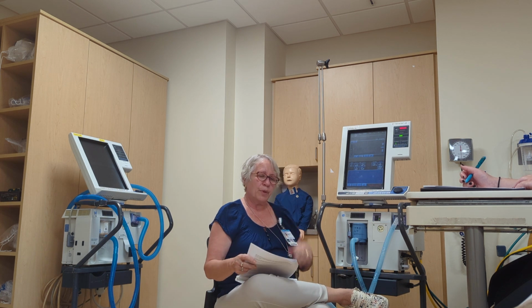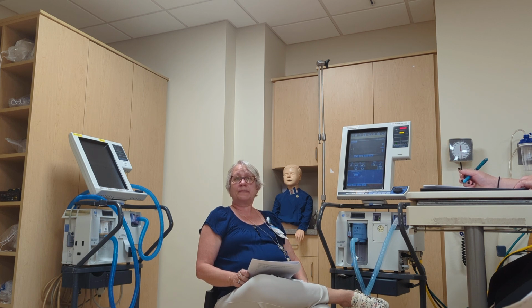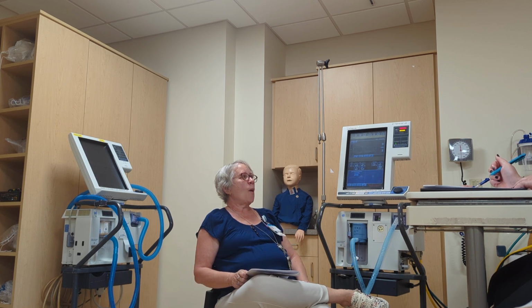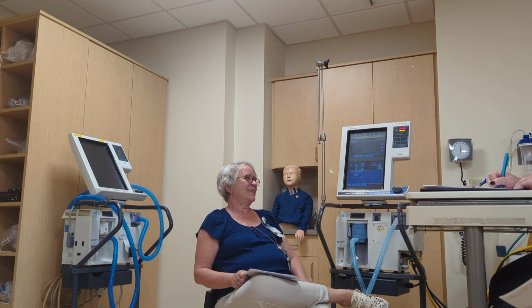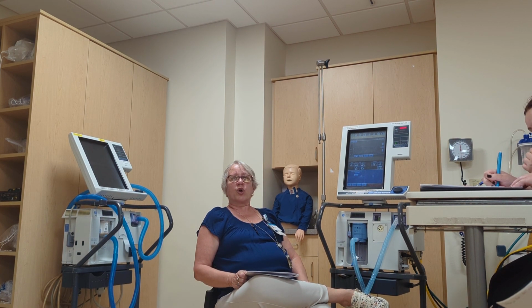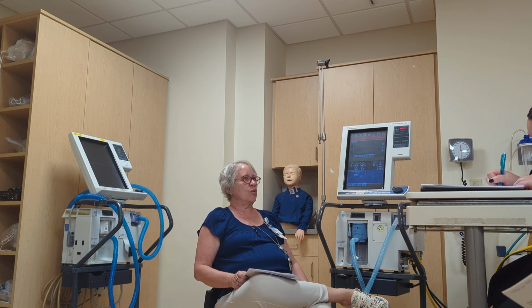I have my tubing compliance number, which was 2.89. I want to take that and multiply it by, what was the number we got up there? 27. Multiply it by 27. And what do you come up with? 78.03. Well, we'll just go with 78. For each breath we are giving, we are losing 78 milliliters of volume. It's staying in the tubing. Does that make sense?